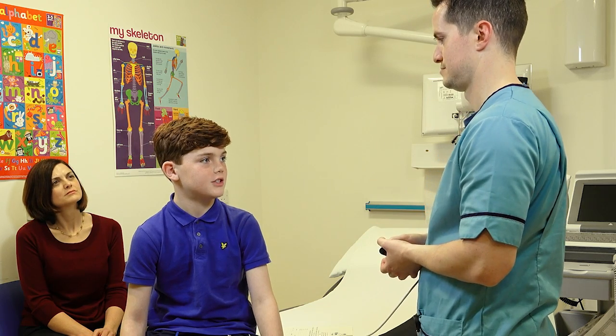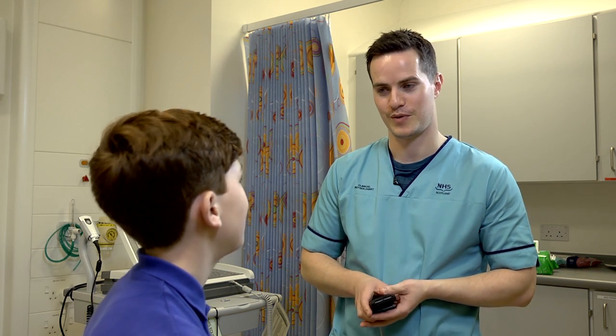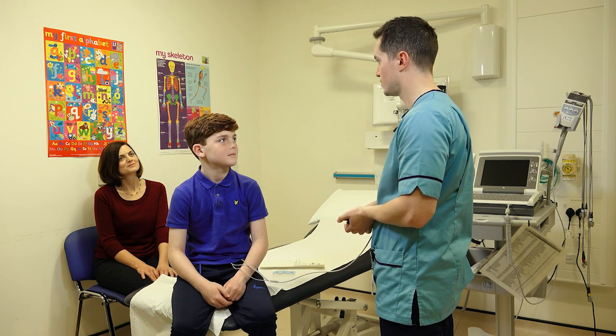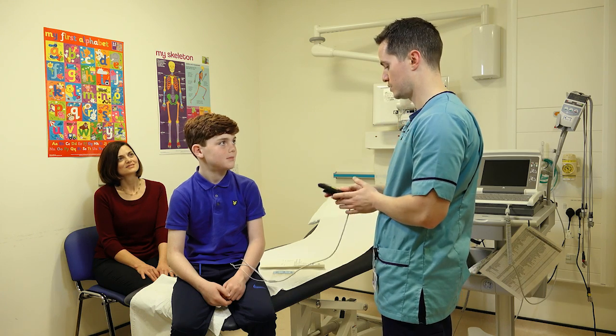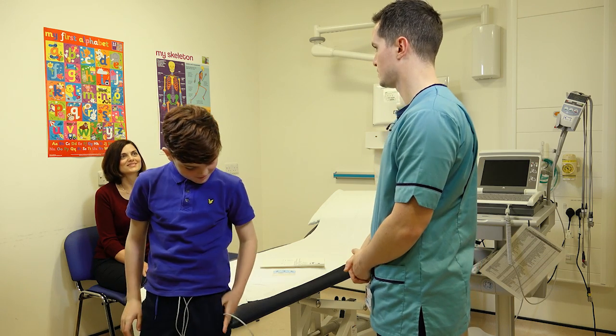So what do I do when I need to shower or bath? Unfortunately, that's the only thing you can't do while wearing this monitor. So for the next 24 hours, there'll be no shower or bath for you. Is there anything else you need to know before you leave with the monitor? No. Okay, that's you all done then. I'll give you the monitor — you could probably put that in your pocket. You're free to go and I will see you this time tomorrow.